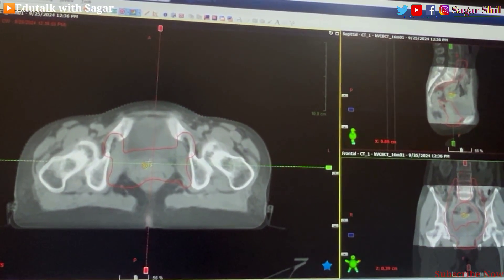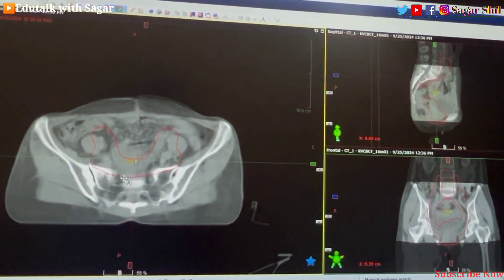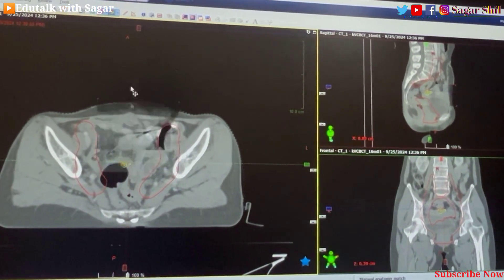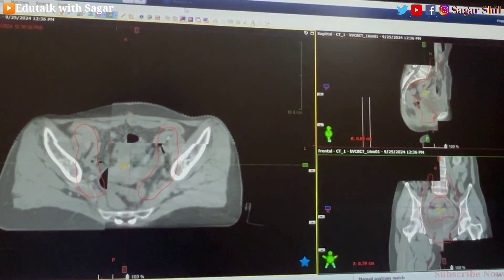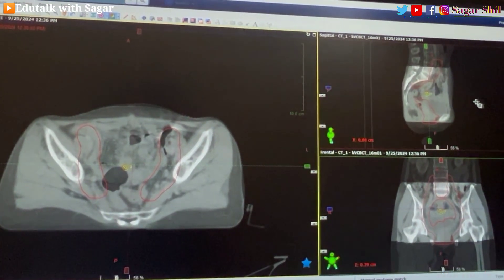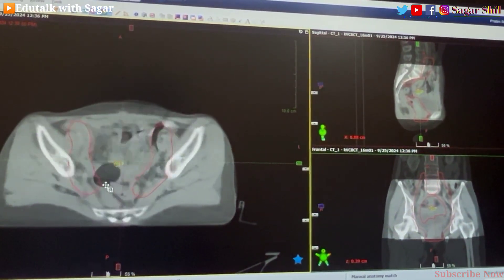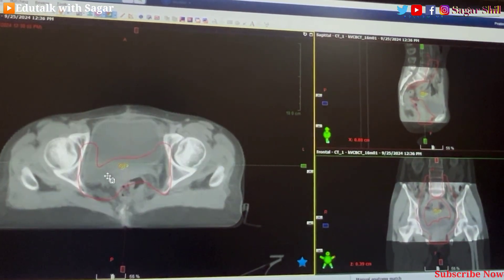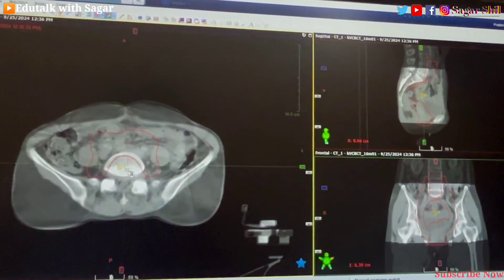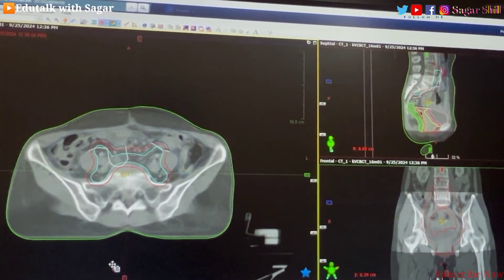If you can see small small variations, you can understand how to match. For viewing variations, windows are available: single window, split window, and coloring view. With the help of these features you can match all images. But keep in mind our tumor also — the radiation dose given should be maximum dose in the tumor and minimum dose in the surrounding tissues.